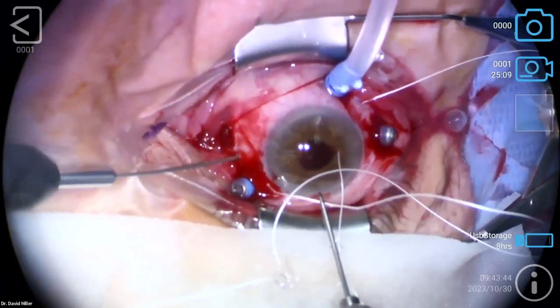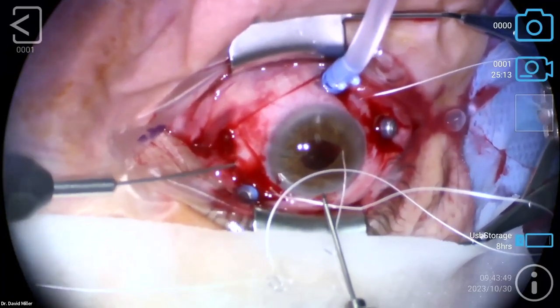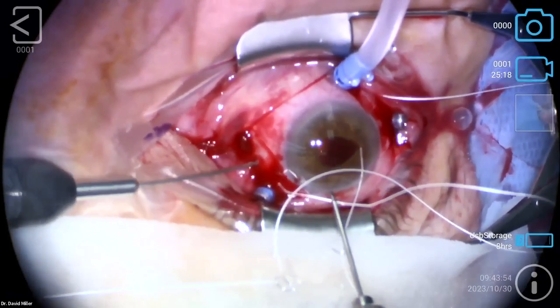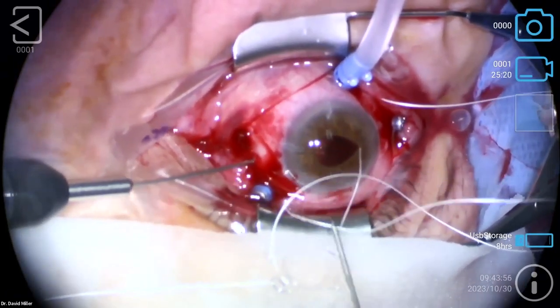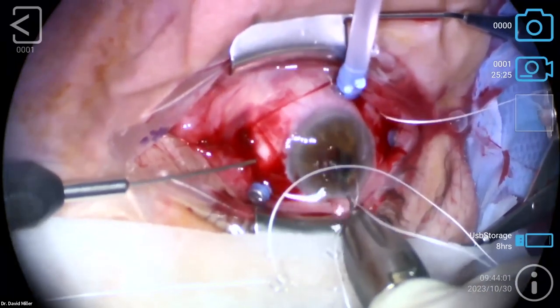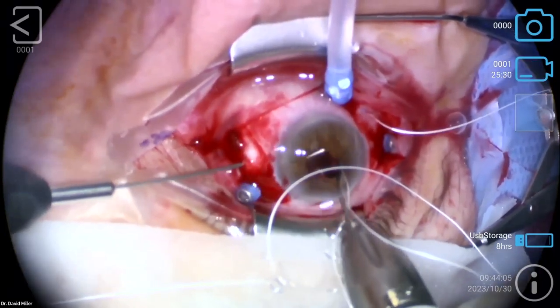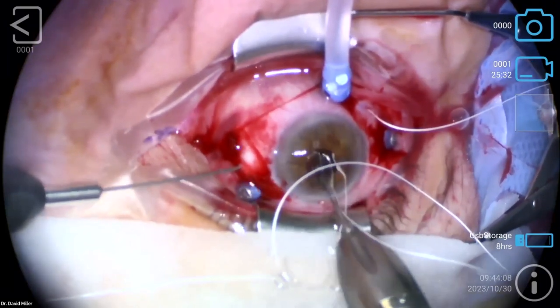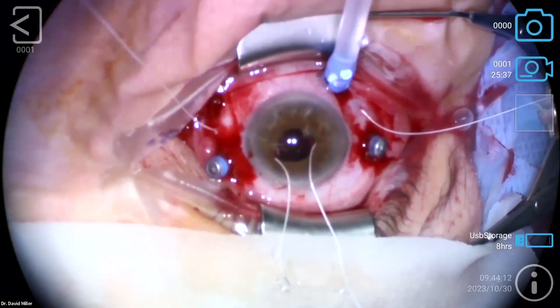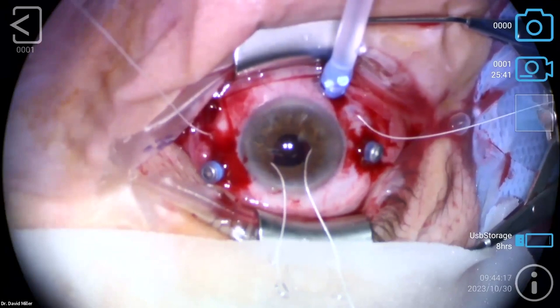On occasion, it's a little tough to get the forceps in the right angle. You can bend these forceps. They're disposable. But I can see this one pretty well, I think. Make sure we're not crisscrossed anywhere, and we're not. And there we go. That doesn't have to be too exact. The eye gets a little distorted, which blows the optics when it's that deep. But we're fine. So now we're going to fold the lens implant.